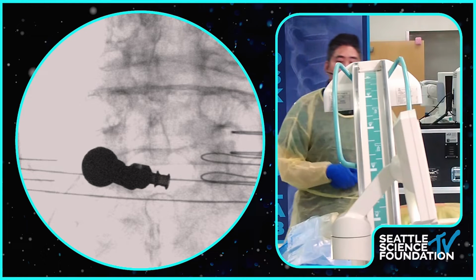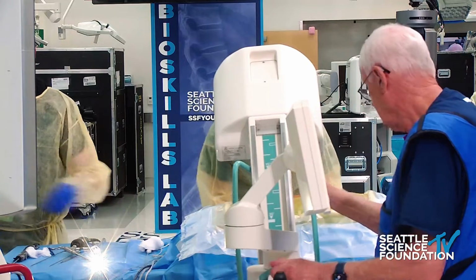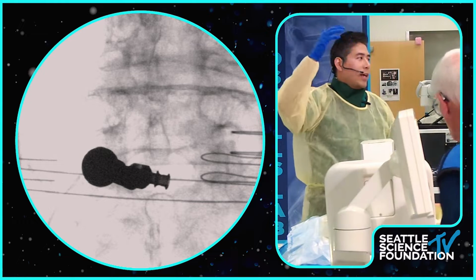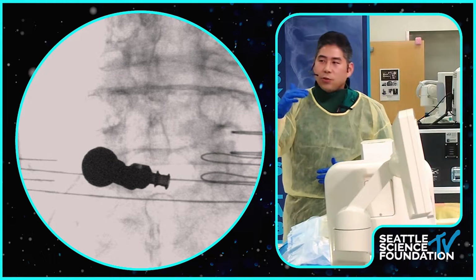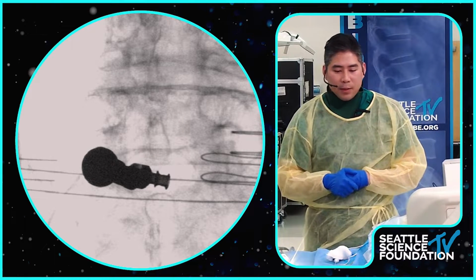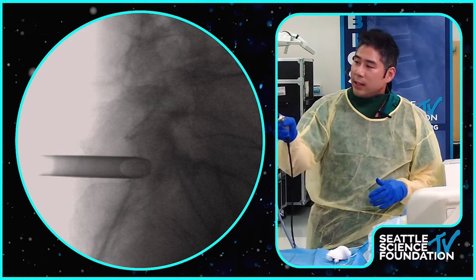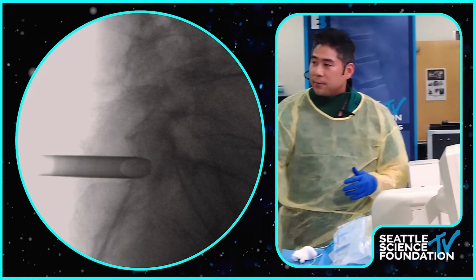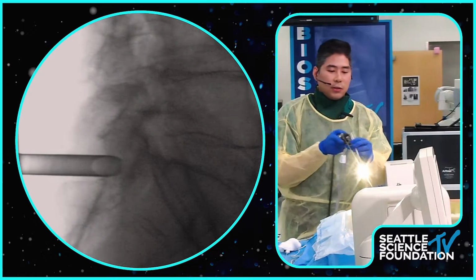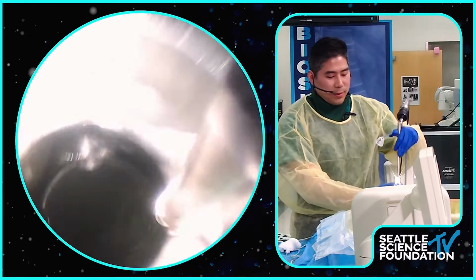So now let's go to the lateral. And I just want to make sure that my tube is not too deep. So you want to see the tube not all the way hanging out in the spinous process, but you want this tube just above the facet joint. So we know that it will be when I stick the scope. So that's perfect. So that's the facet line. If I angle up a little bit, there'll be the L5-S1 space. So now I'm done with the fluoro. So you can move up.